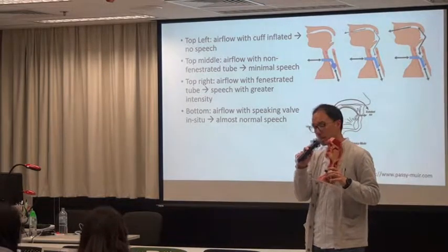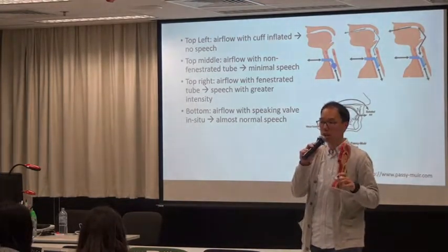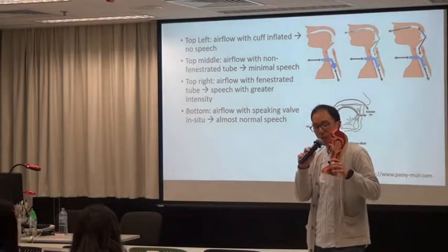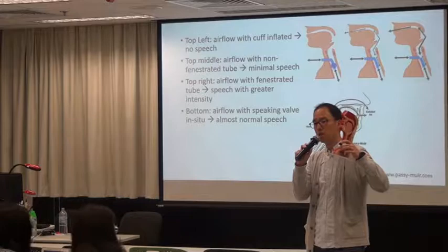Okay, this is something that I have to remind the patient and the relatives a lot of times. You have to anchor the tracheostomy tube really well.